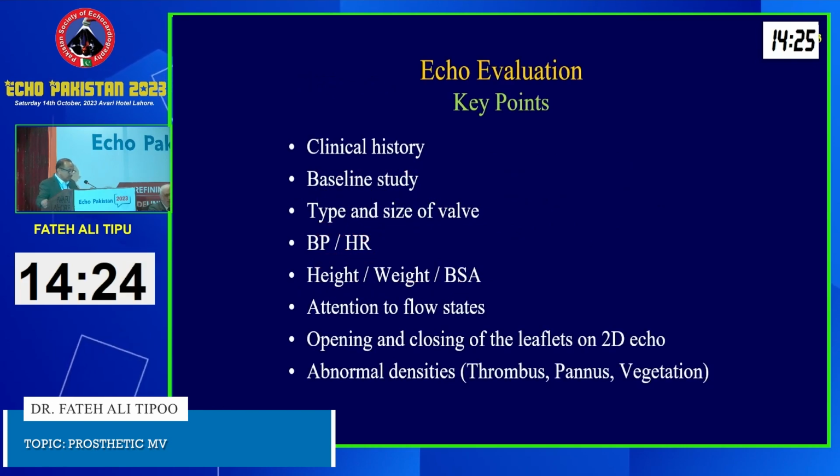While doing the assessment of prosthetic mitral valve, the thing which is very important before starting the echo is the clinical history. We should know the presenting symptoms, whether the patient is presenting with shortness of breath, or decreased blood pressure, or fever, or maybe suboptimal INR. These things are very important before starting the echocardiography.